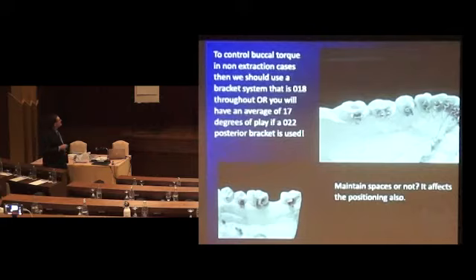Here is what I talked about outside — on her table. See that? That's a labial bracket — an 018-slot labial bracket bonded on the lingual. We can do it. Some brackets, you can bond labial brackets on a lingual. But don't try and bond a labial bracket on a lingual incisor.